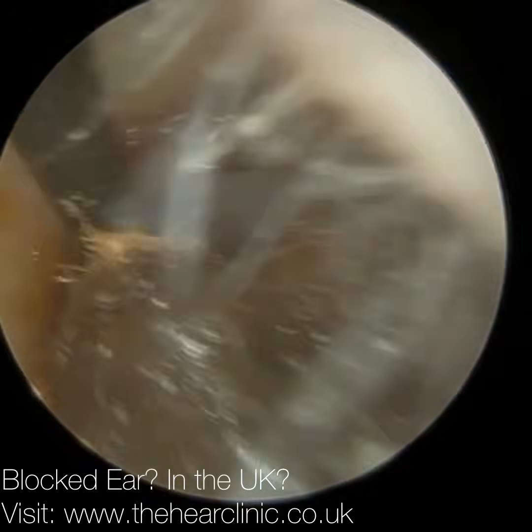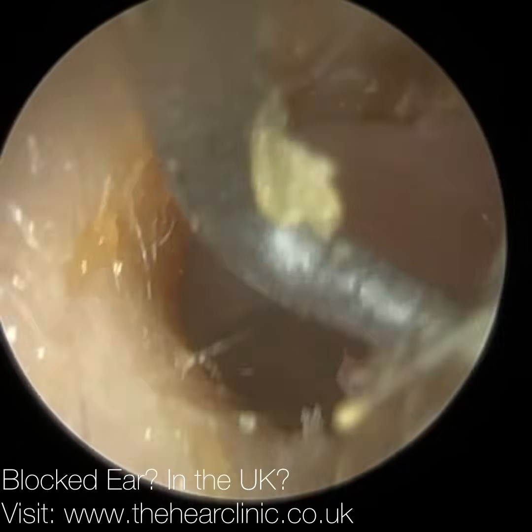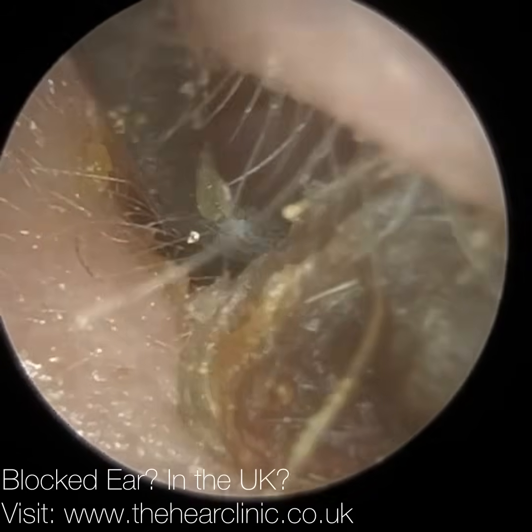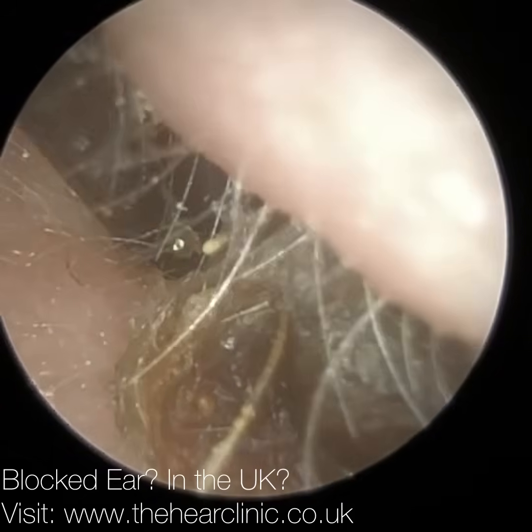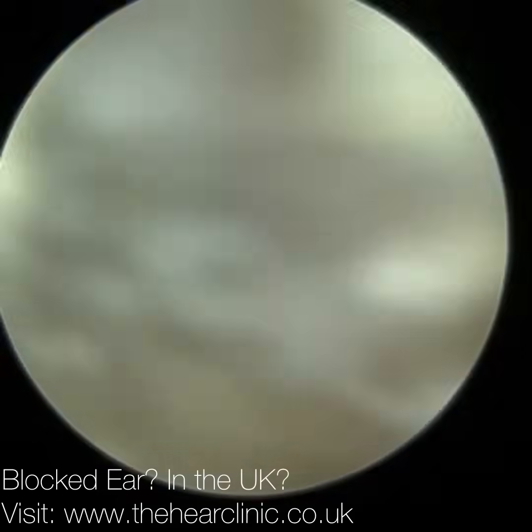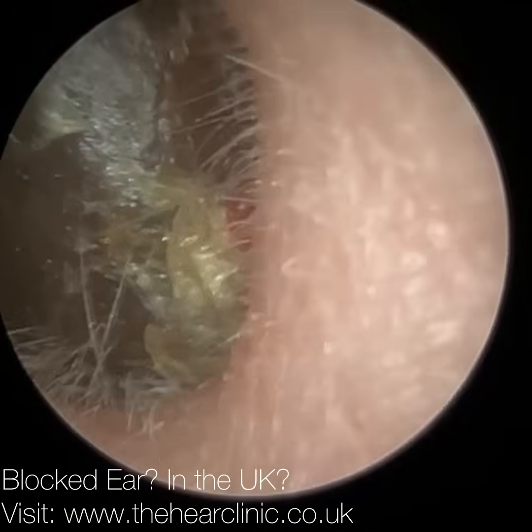It came away without a fuss and I thought, okay, that's a nice quick easy one — which has not been the norm recently, as I've had loads of challenging cases which I will upload in due course. But as I'm bringing this out, you're going to see just at the top there there's some dried blood and a lot of dead skin — you can see it better there. And I knew obviously there's something going on in the ear here.